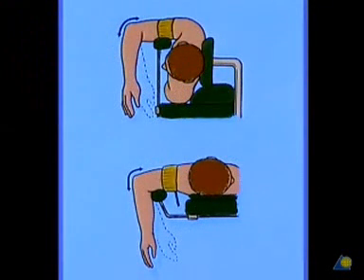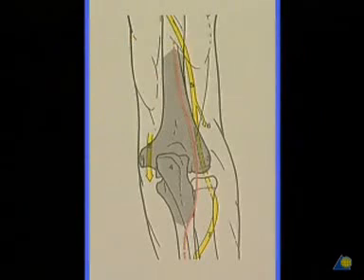For surgery, the patient is placed in a lateral or prone position, the humerus abducted at a right angle on a radiolucent support. The entire arm is draped and freely movable. The fracture is exposed through a straight incision from the ulnar crest to the middle of the humerus, curving slightly around the olecranon on the radial side.